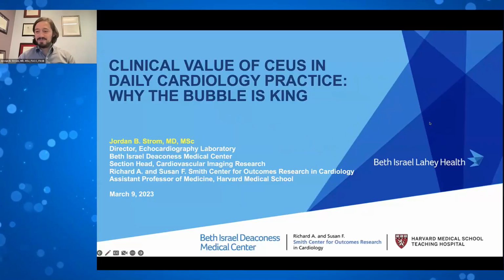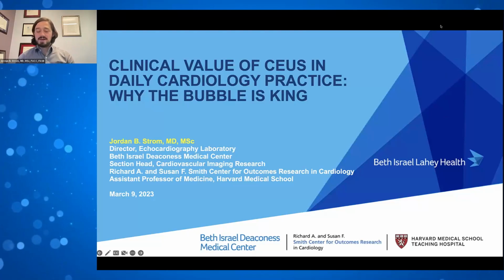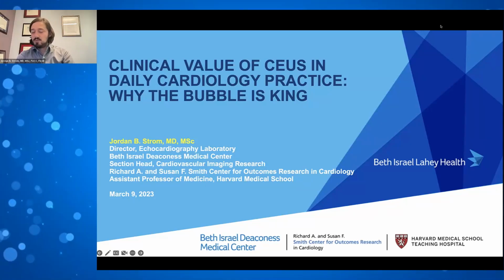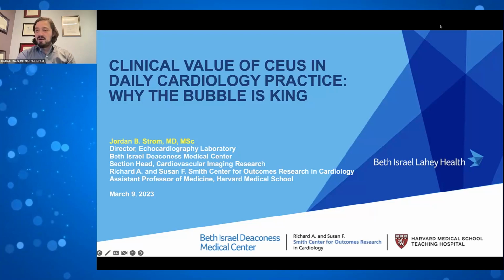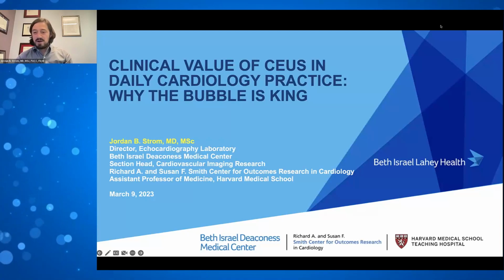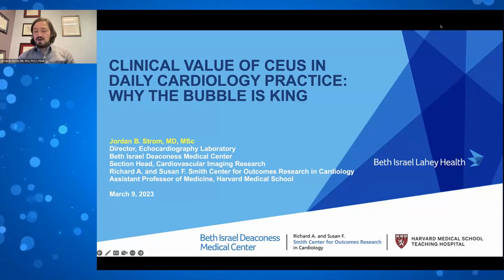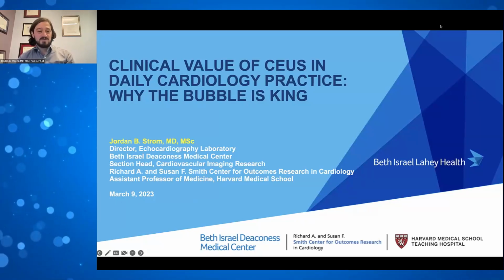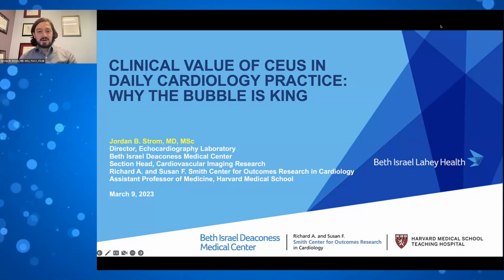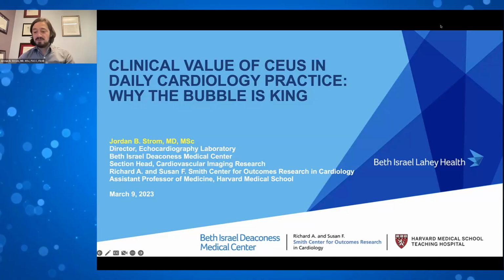Thanks for the introduction, and it's very nice to be amongst esteemed colleagues here. We also use contrast quite readily at Beth Israel Deaconess Medical Center, where we've grown the program from about 2% contrast use to about 22%. We know about 10 to 20% of all echocardiograms have suboptimal image quality, and we have our sonographers trained and credentialed through the hospital. We do an annual training and credentialing process with them to make sure that they are able to give and do give contrast at bedside. They do this based on the review of the images, and that's worked very well in terms of getting this important technology into the hands of individuals.